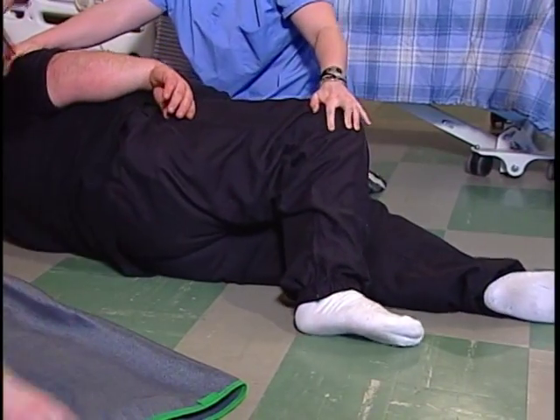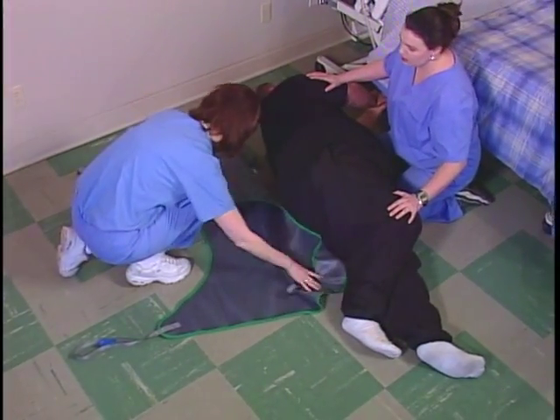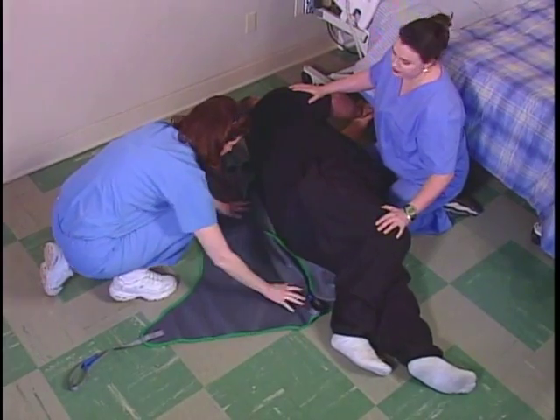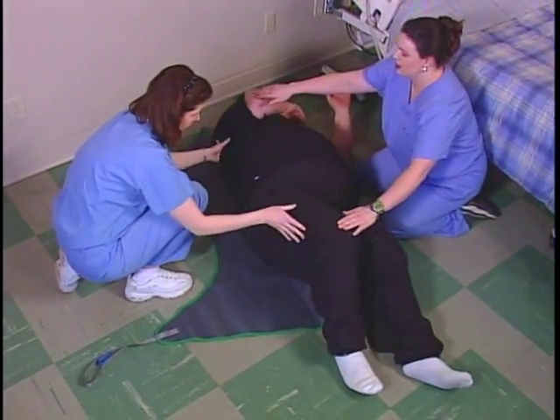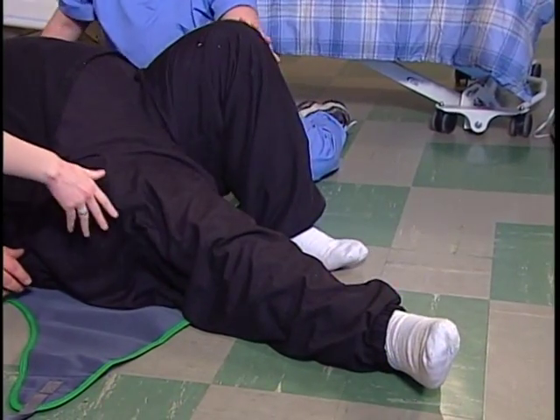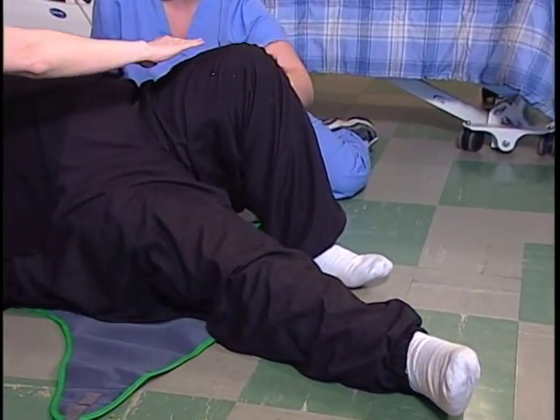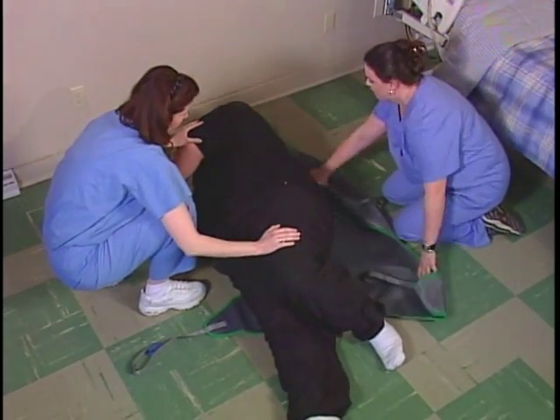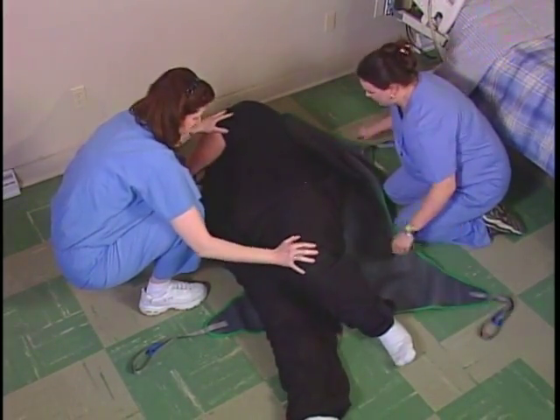Come towards me. With one caregiver holding, the other caregiver can push the sling under the resident. Come back. All right, come on. Roll the resident onto their back. Straighten this leg out and then bend the other knee. Roll the resident over onto their other side using the same technique. This makes it possible to roll the sling out smoothly on the floor underneath the resident.